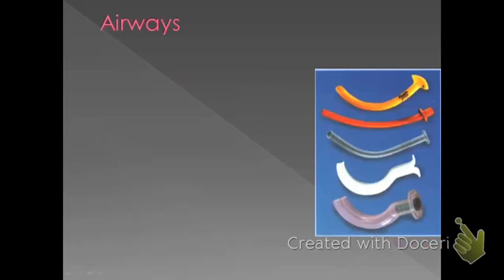Specifically, we're talking about the bag valve mask, we're talking about the resuscitation mask, but in addition to that, you might also have to utilize supplemental oxygen, or you might be forced to administer oxygen to your patient. And oxygen could truly be a life-saving drug. It has already been said, and is worth saying again, if you do anything for your patient, the airway care that you provide, opening it and maintaining an airway and ensuring adequate breathing, is probably one of the most important things that you as a first responder will ever do.